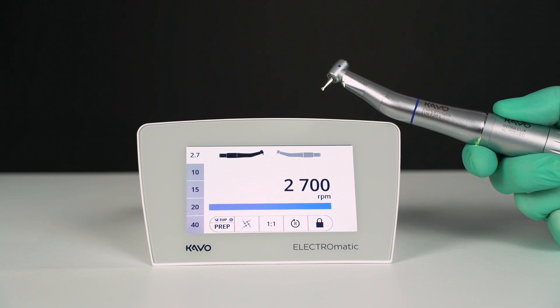Here, an Expertmatic E20L with a 1-to-1 ratio is chosen. Therefore, the maximum possible speed is 2700 rpm.